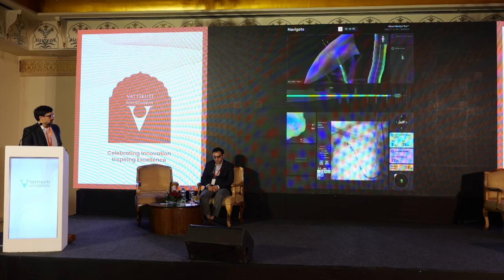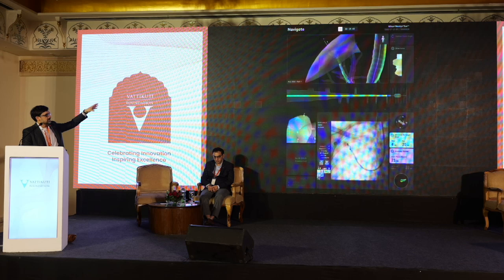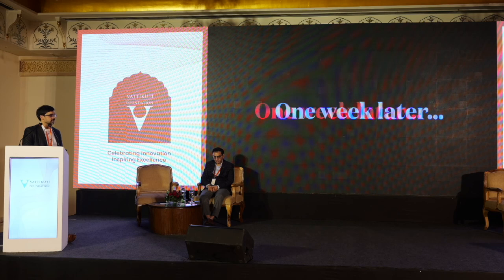And so you can see that it's sitting pretty well into the lesion in question. The other marks up there is the pleural border, so you can see in the purple in the top pictures the pleural border piece, so you can see how peripheral we can get with these.